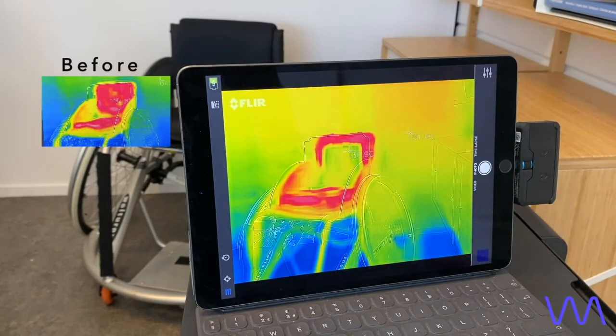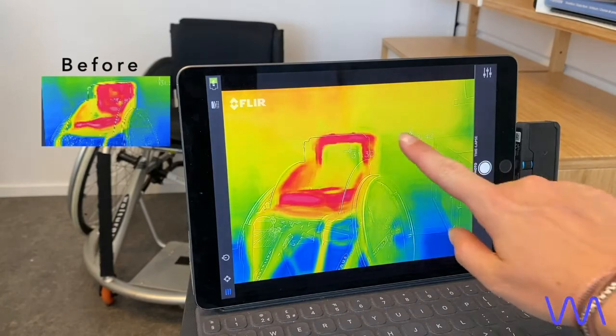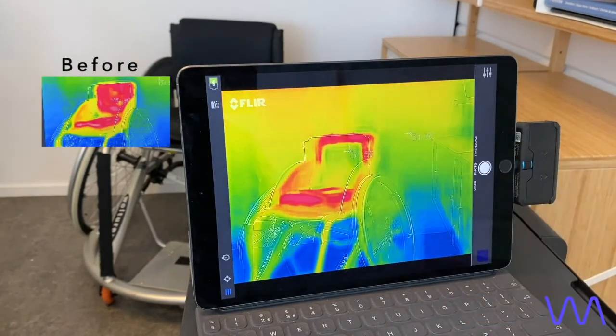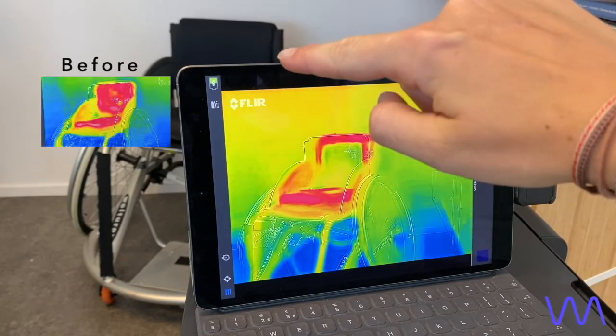Quite clear, I think, if you look at the colors alone. As you can see, it was close to getting to the environment temperature, and it would have dropped further as time continued. You can see exactly that it spreads where we have the breathable mesh on the sides. Where it is darker here, that is the frame of the chair and the cushion there. So you can see that here, these parts here.